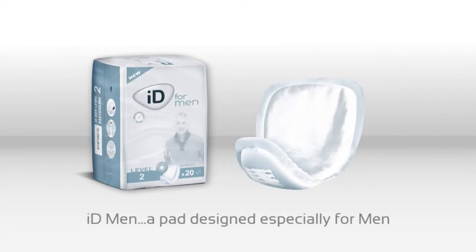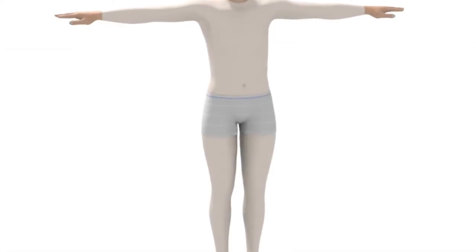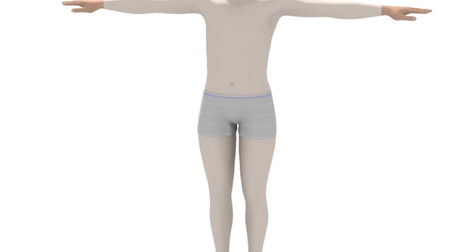ID for men are ideal for managing light urinary incontinence in men. The male-specific design enhances comfort and security. The shape and adhesive strip ensure a secure fit in conventional underwear. These products should always be worn with ID Expert Fix elasticated fixation pants, which help keep the product correctly in place, or the patient's own close-fitting underwear.